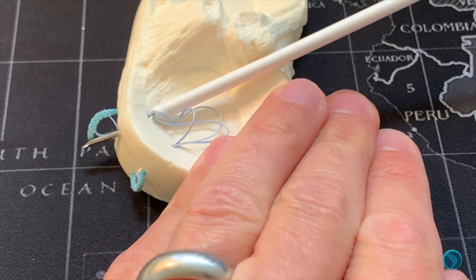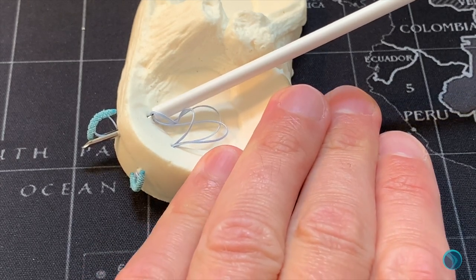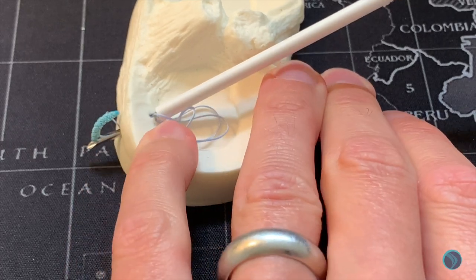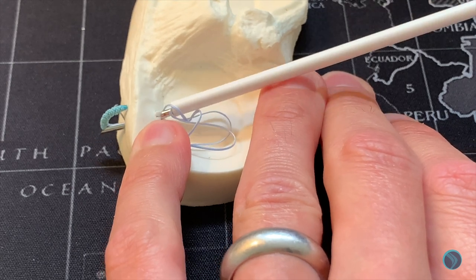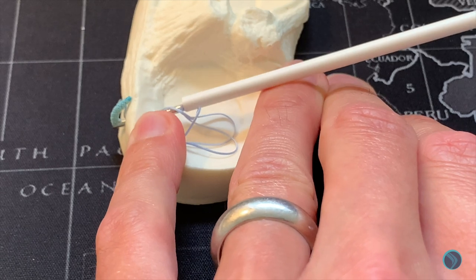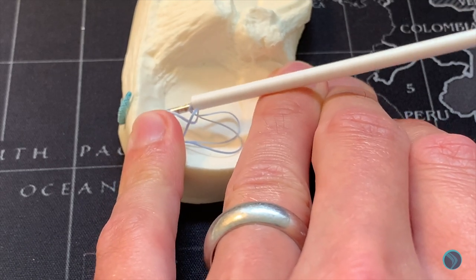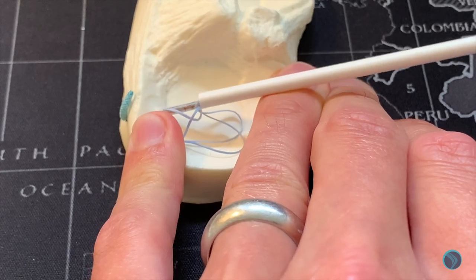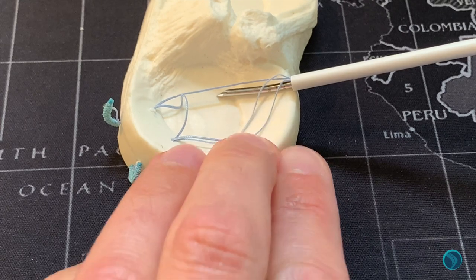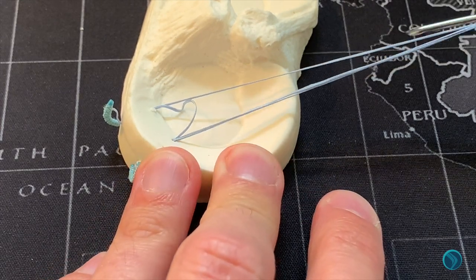Moving back to the model, you can see the posterior capsule with the second fibre stitch implant deployed. Simply remove the needle into the joint, leaving the device posteriorly, and then removing the device through the portal.